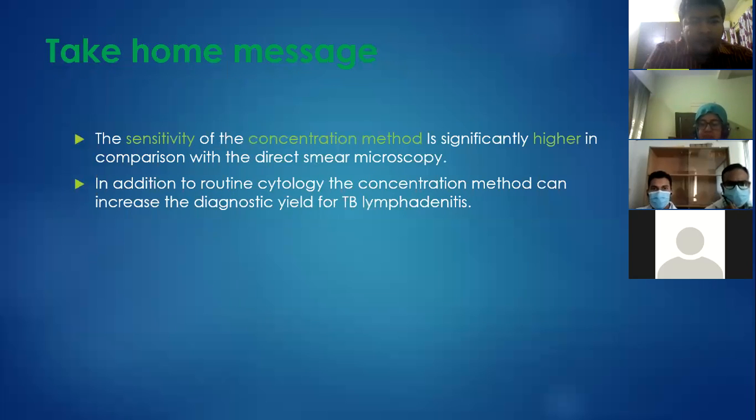And here is the message that we can take home: the sensitivity of the concentration method is significantly higher in comparison with direct smear microscopy. And in addition to routine cytology, the concentration method can increase the diagnostic yield of tubercular lymphadenitis.